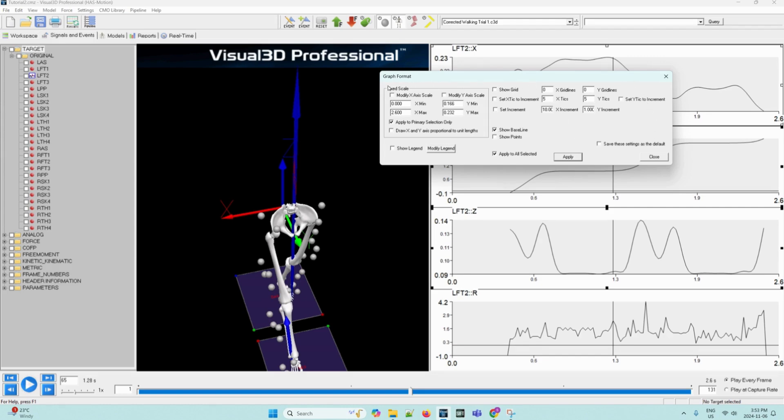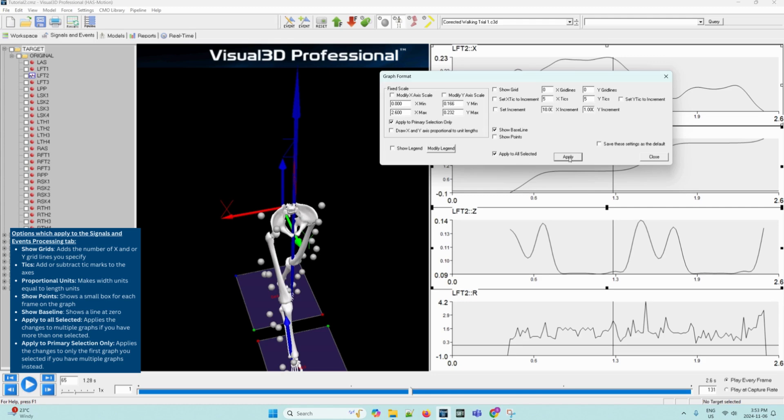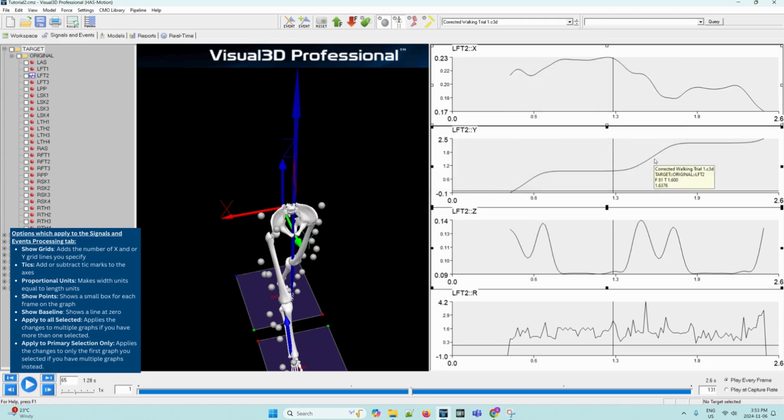And once you've entered your desired changes, you can click apply for it to be shown on the graphs. A note is that not all of the options apply to the signal and events processing tab. The following are some of the options that do apply: Show grid, ticks, proportional units, show points, show baseline, apply to all selected, and apply to primary selection only. Once you're done making your desired selections, you can click apply and then close this graph format tab. Now the changes should reflect on the signal graphs.